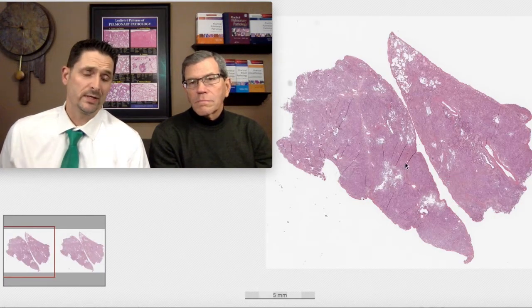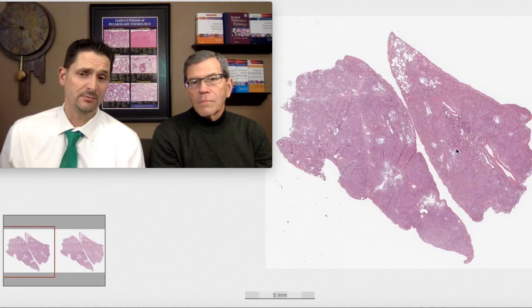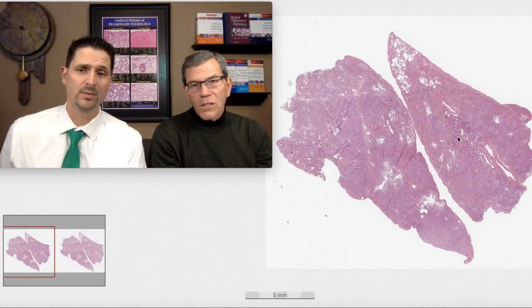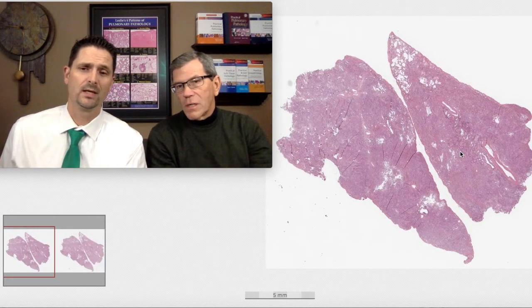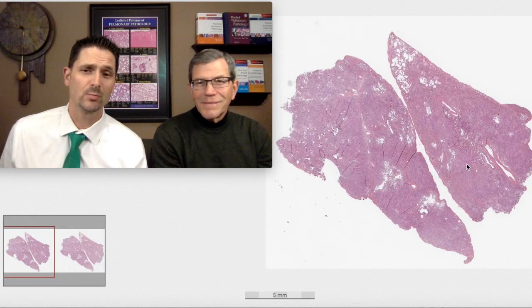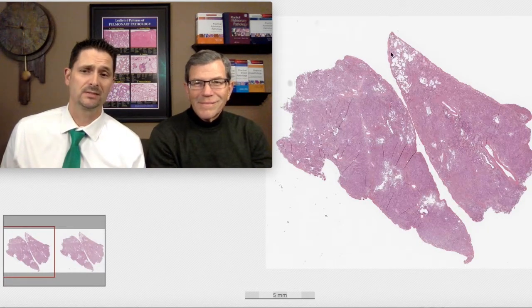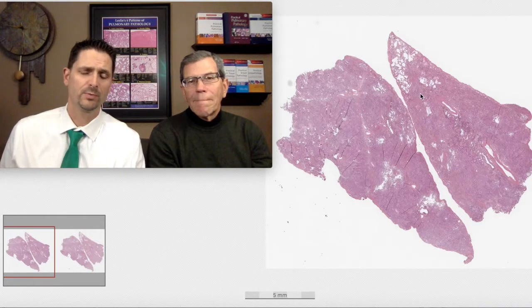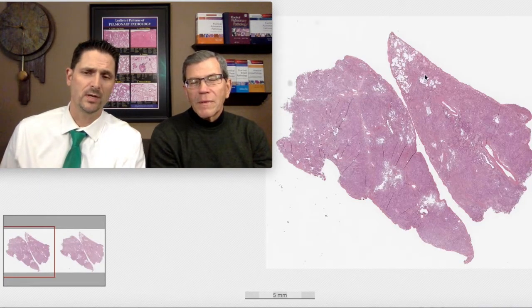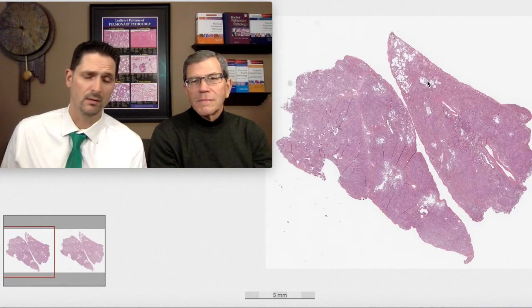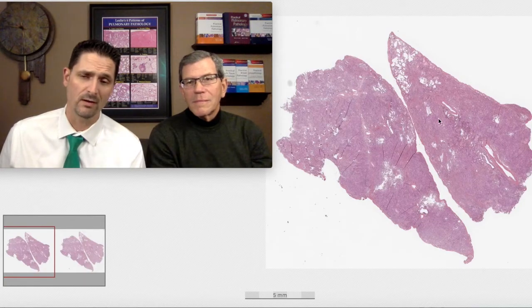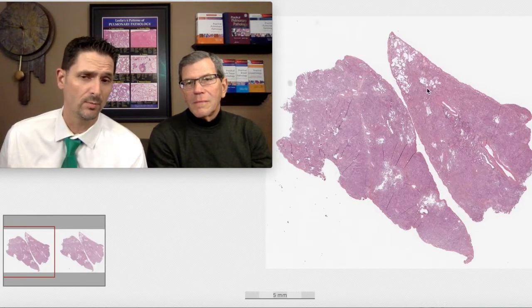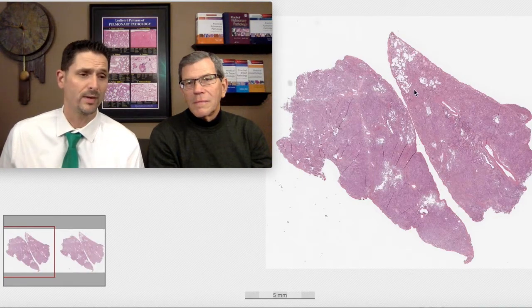We can look at this biopsy and say it's consolidated — it looks more like liver than it does lung, with the exception of this area right here. So it makes perfect sense that this patient would be showing extensive areas of consolidation with maybe a little bit of ground glass opacities.